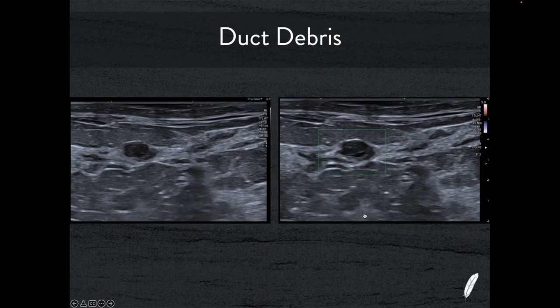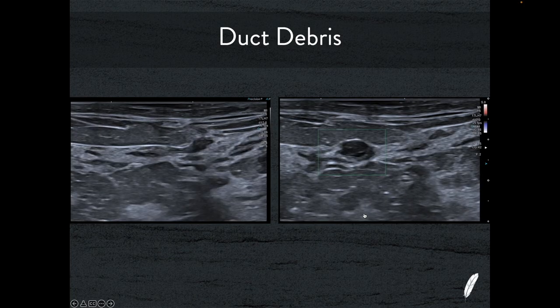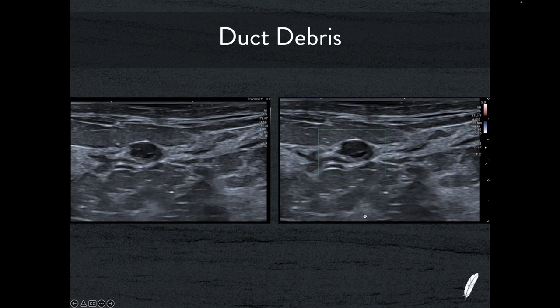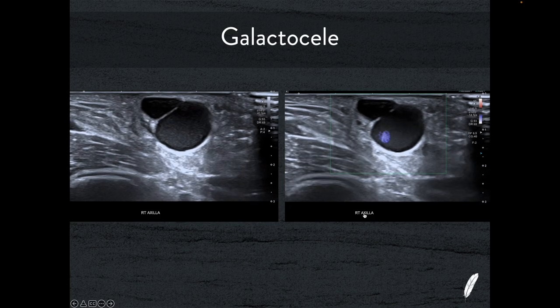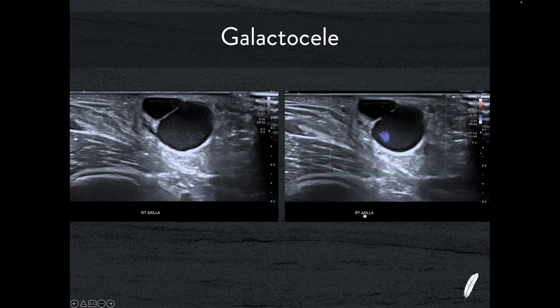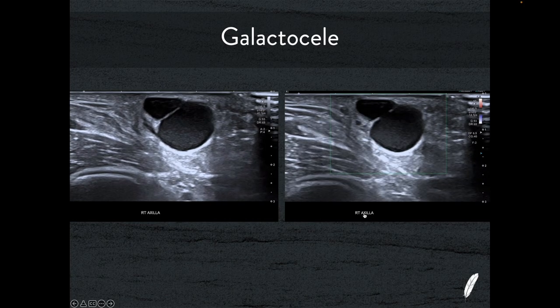This looks very similar to the papilloma I just showed you, however the advanced dynamic flow in this case shows no evidence of any flow within it — this is just a little bit of inspissated material, a normal secretion inside the duct. This is a breastfeeding lady and we're scanning in the axilla where there's a palpable lump. This is just because of a blocked duct — accessory breast tissue in the axilla has formed a galactocele.